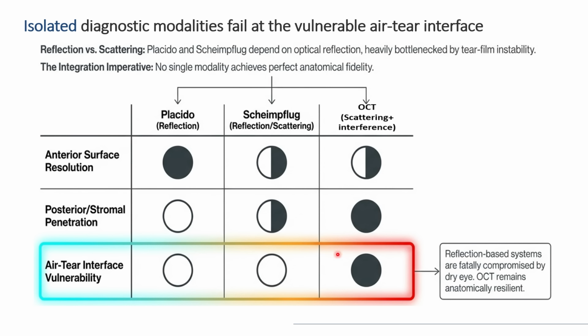However, the utmost combination, the use of OCT, will provide very good details for the anterior surface, the subsurface structures like the stroma at very high resolution, and also very good information about the posterior surface. And it is not only the visualization, that's the resolution, but also the reliability of the data. So we have two important variables: we have to have reliable data, as well as very clear data. So this combination technology is now the gold standard for screening for keratoconus or for imaging of the angle structure and detailed trabecular structures.